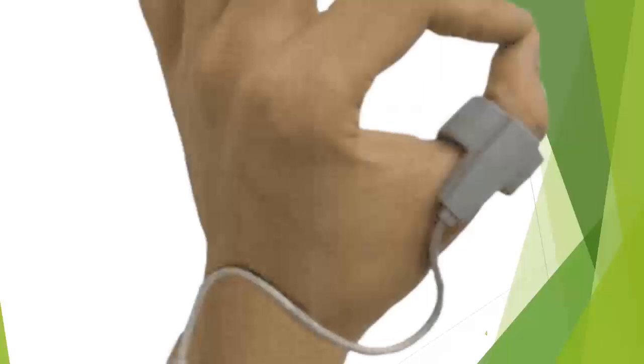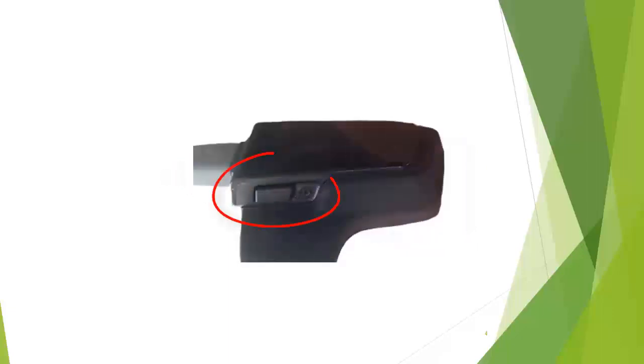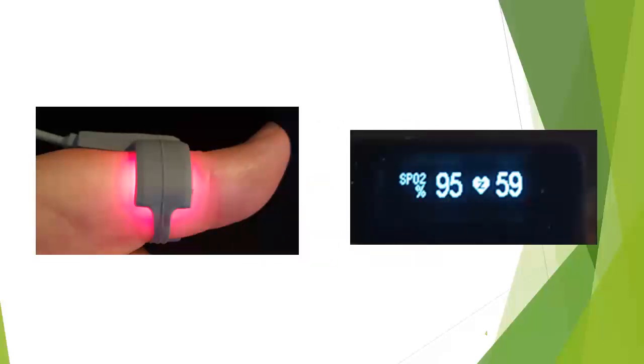During the study, it is important to not remove the thumb sensor. However, we understand there may be a good reason to do so. If you remove the thumb sensor, you will need to power off, then power back on the wristwatch. This is an important step, as once the thumb sensor is removed, the wristwatch stops collecting data until this step is performed. You will know the wristwatch is working if you see numbers on the screen and a red light will appear on your thumb. This indicates the wristwatch is powered on and recording.